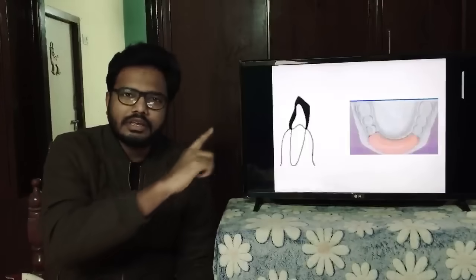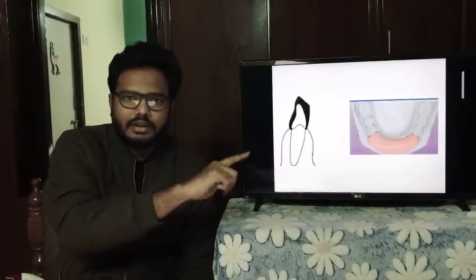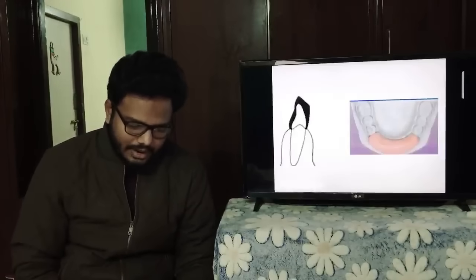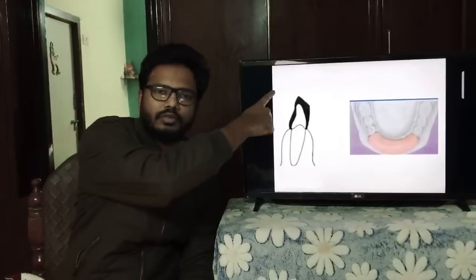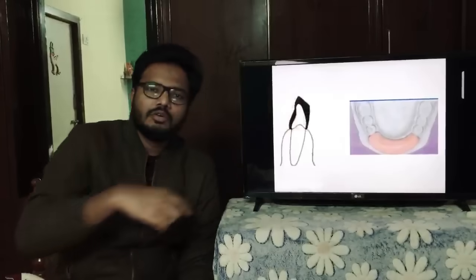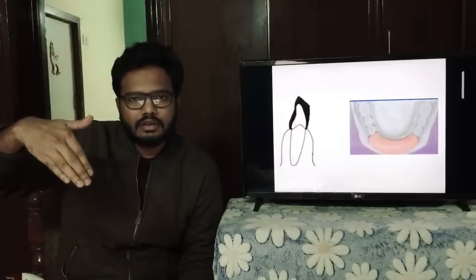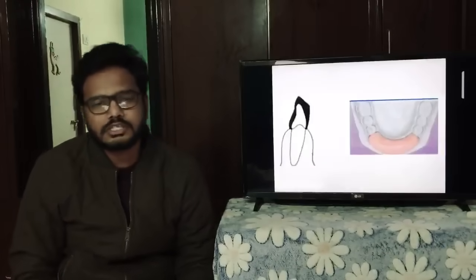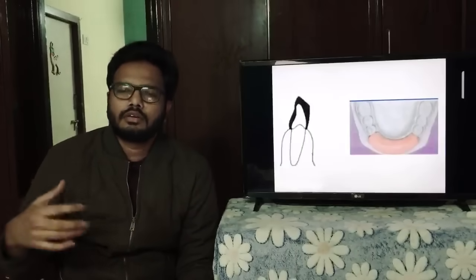Next one, identify the appliance. I've even given the cross section on left side. Right side you can see the model or the appliance on a cast. Identify the appliance which is used for correcting anterior crossbite. You can see in the cross section we have a 45 degrees plane which enables the maxillary teeth to slip or to slide in a more forward position. So it's used for correcting maxillary anterior crossbites. I'm sorry. So identify this appliance.